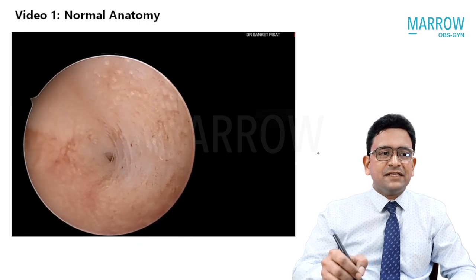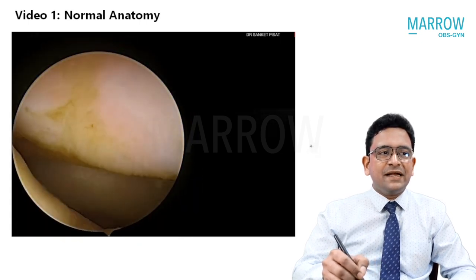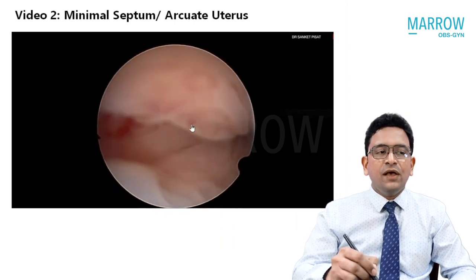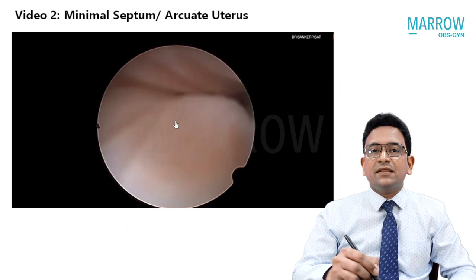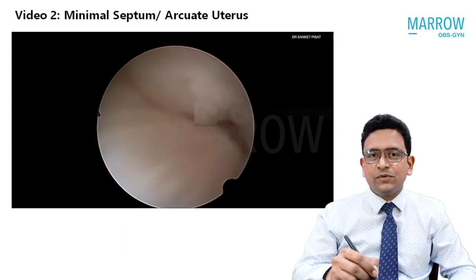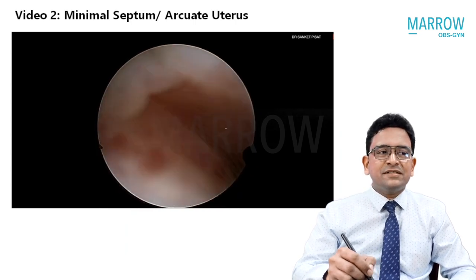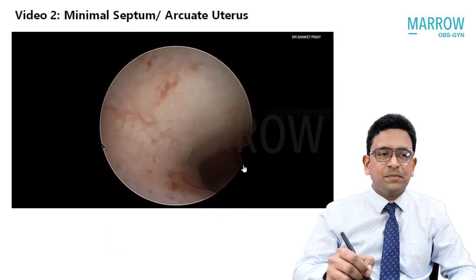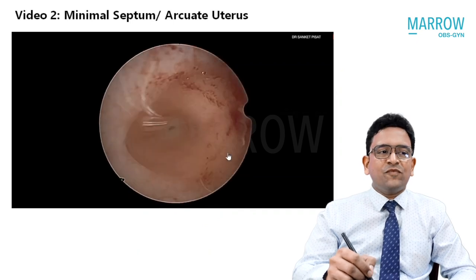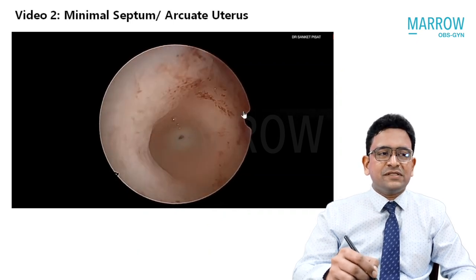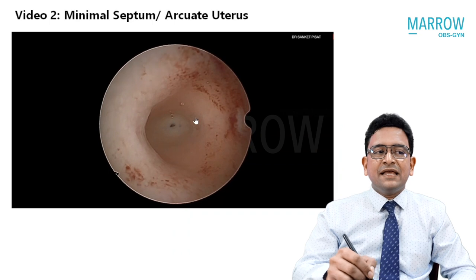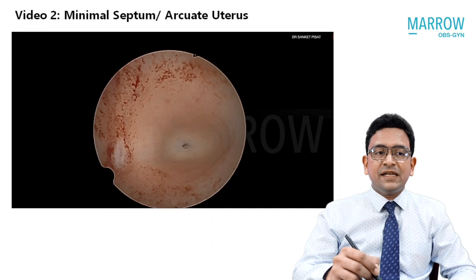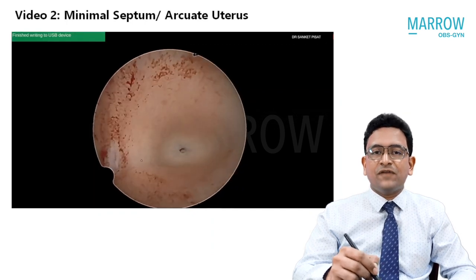Let us now move on to the next slide, which shows a minimal septate or arcuate uterus. The telescope is going inside the uterine cavity; we gradually negotiate through the cavity, and the internal os is slowly coming up. As the telescope finds its way through the internal os, you will see in this area that there is a dip in the center.